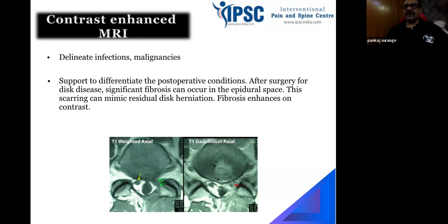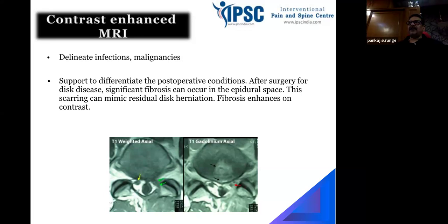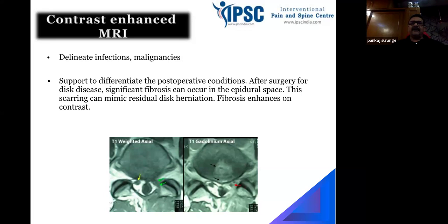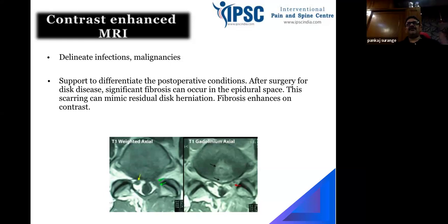Okay, understood? Clear? So till what duration is the MRI valid, sir? If a patient comes with a previous MRI of 3 months duration or 4 months or nothing? 2 months. Not at all. Even if it is 10 days old, if the patient has undergone surgery 2 days back, it is not valid. Simple. No, sir, in general, not about surgery. If any patient comes with back pain, and says I did an MRI 3 months back, or 6 months old, till what time is it valid?